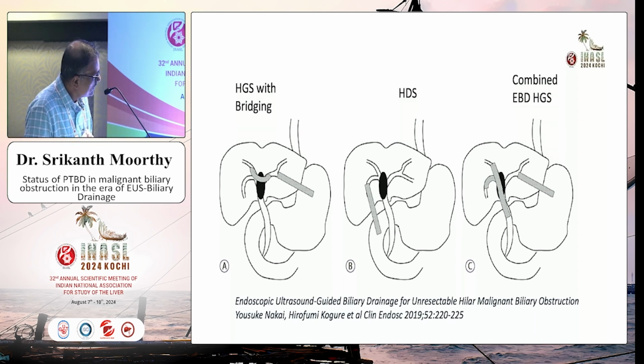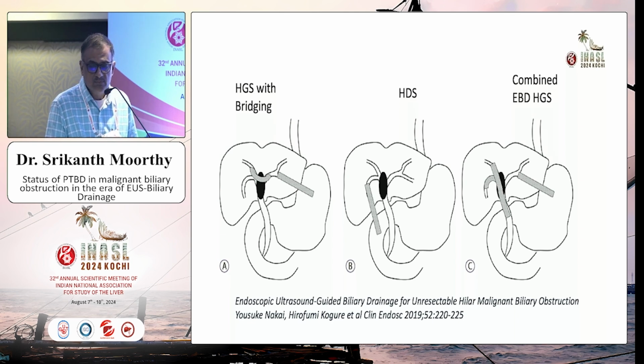But the point I wanted to highlight was the ability of PTBD to access any of these ducts as you please. And sometimes in hilar cholangiocarcinoma, you do not want to inject into certain systems. You just want to drain it.